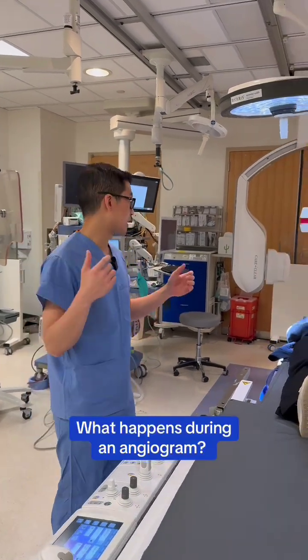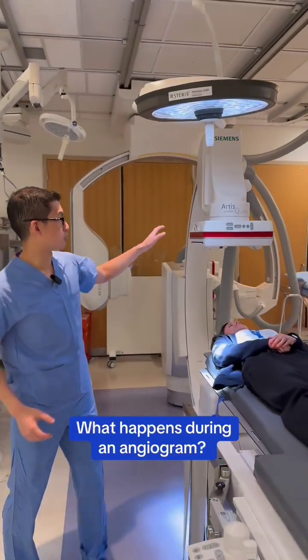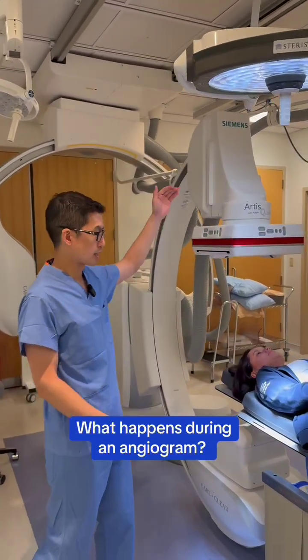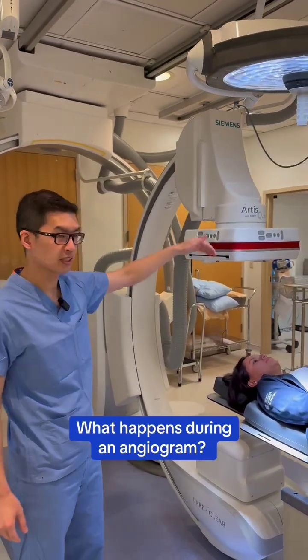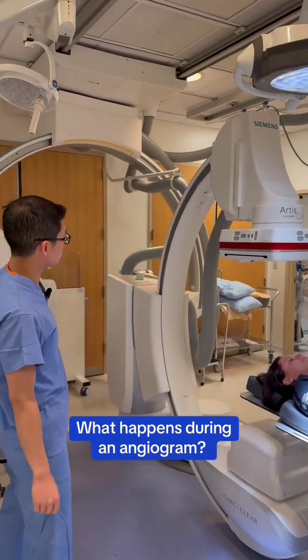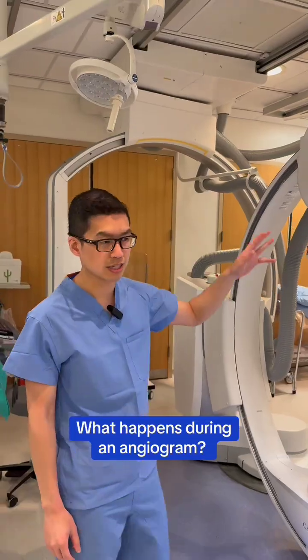As you come around this side, you'll see we have a couple of machines here. We first have what we call the A-plane. This is an x-ray that goes from your face to behind your head. And then we have another one that comes in over the top that looks from side to side.